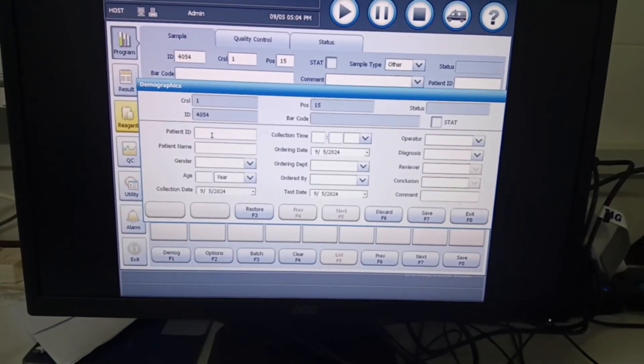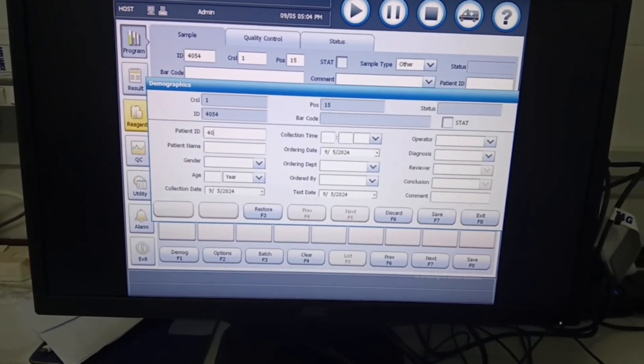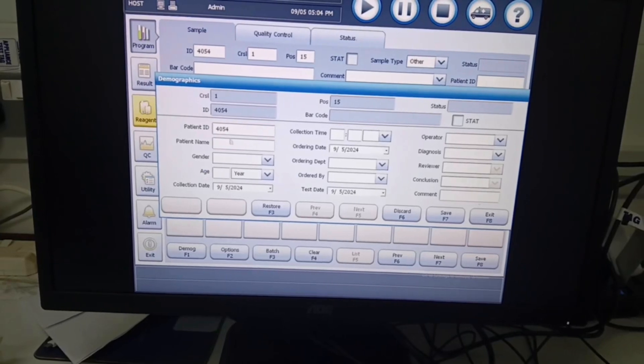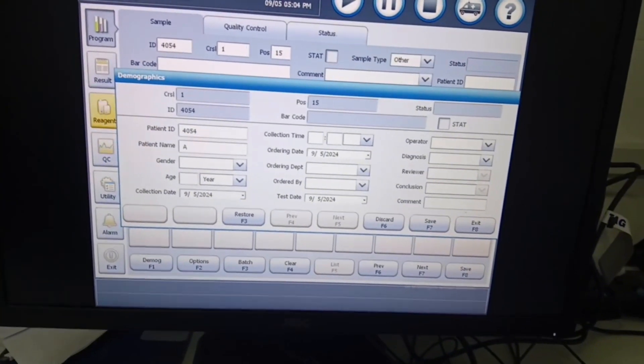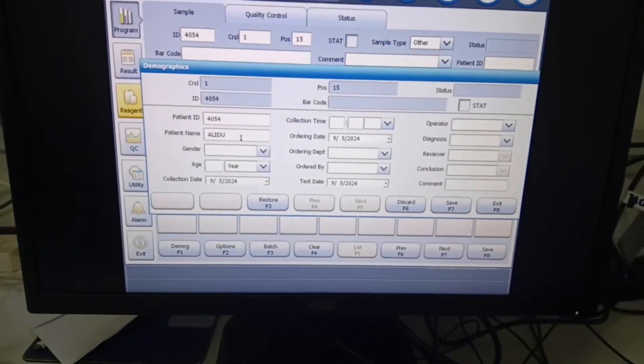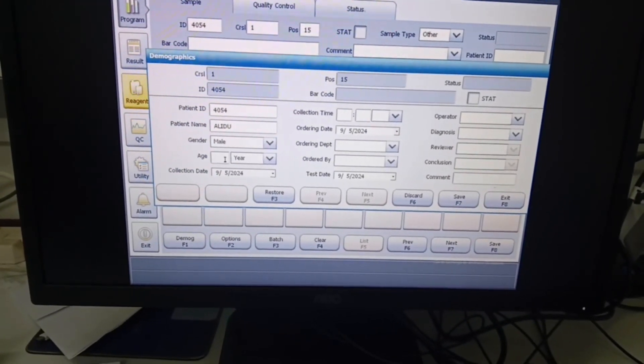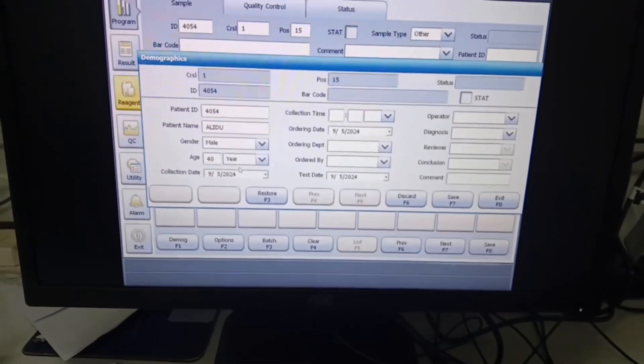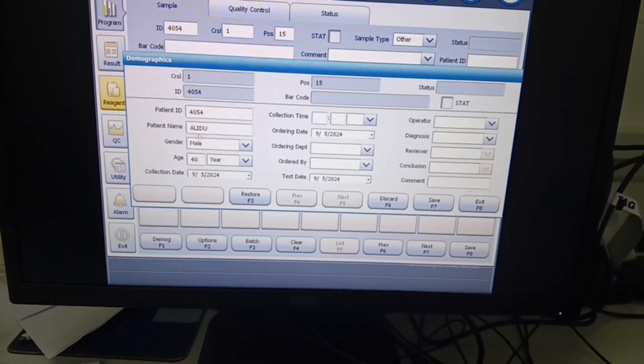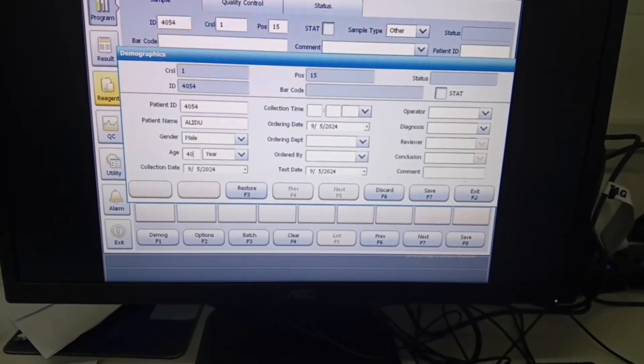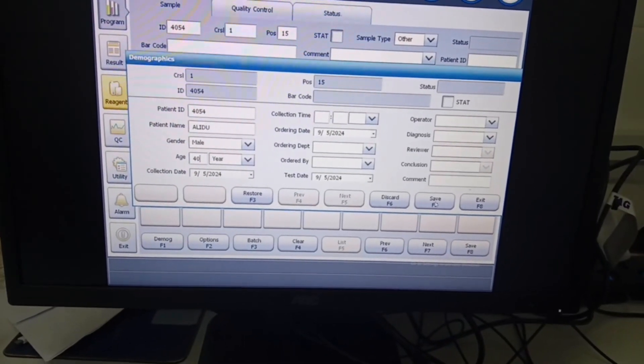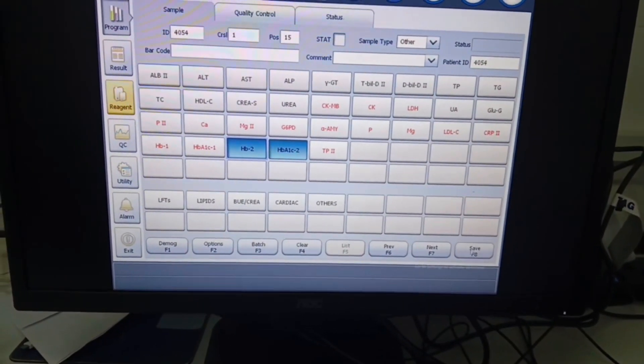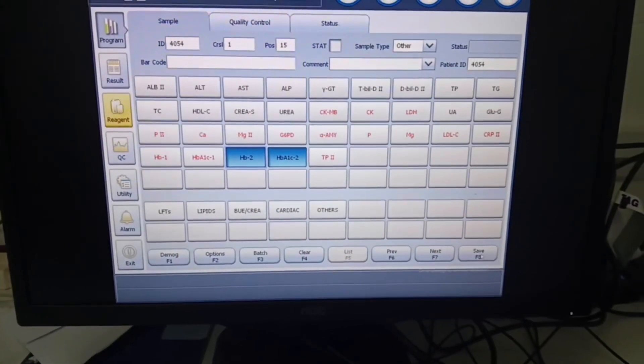So the patient ID is 4054. Let's assume our patient is called Alidu, and also assume Alidu is a 40-year-old male. Once the basic information about our sample has been inputted, we click on F7 to save the patient detail and we click on F8 to save the lab test we have selected.